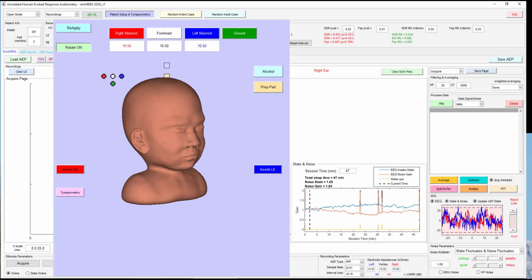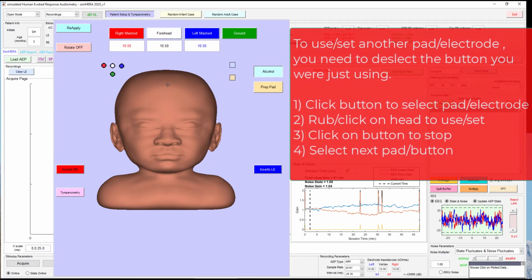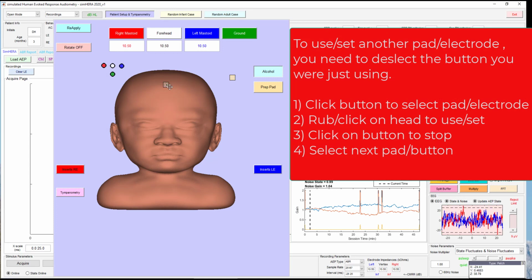Okay, once you've gotten into the patient setup, we're going to go ahead and prep. Click on alcohol, that's an alcohol pad. It takes off the oils on the skin, and we'll prep in two places, one for the forehead and one for the ground. And then click on the prep pad, a little bit more abrasive. It's going to prep the skin a little bit better, so you get a better impedance. And you can see the skin discoloring there a bit.